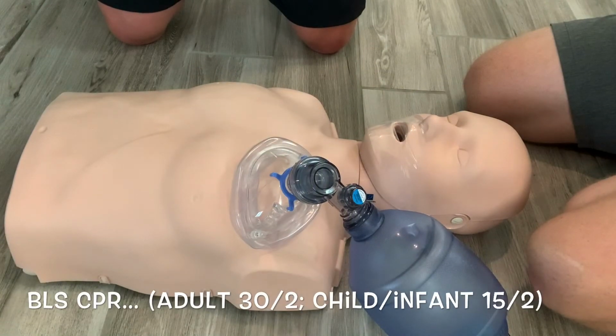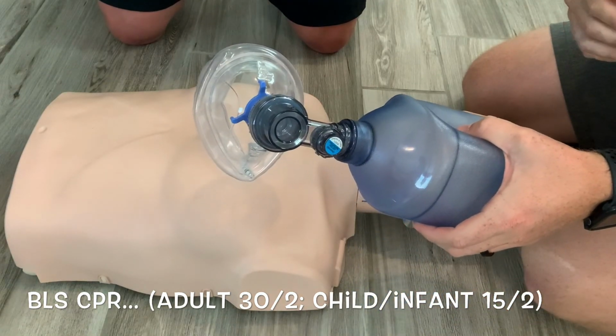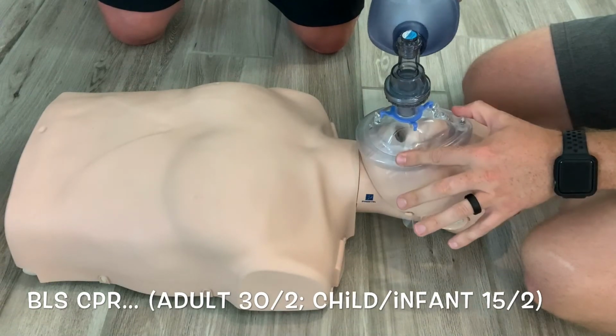During 2 rescuer CPR, or BLS, basic life support, you're going to have one person on the side to perform compressions and one person on the head to perform breaths. How to perform breaths, we're going to use this bag valve mask. We're going to put the mask part over the person's nose and mouth.